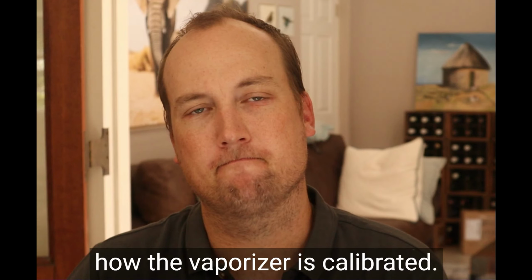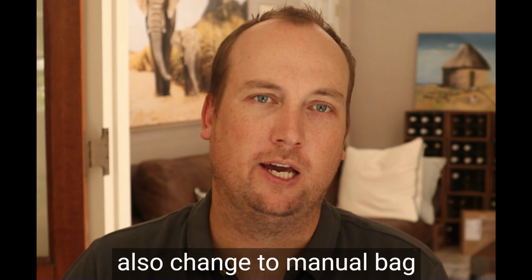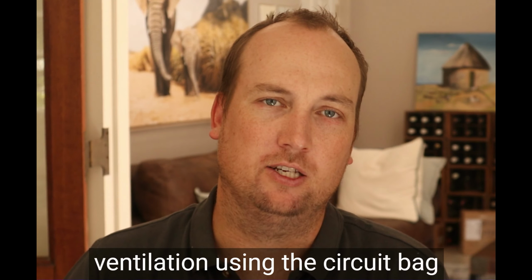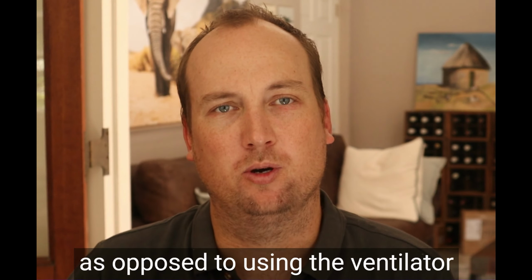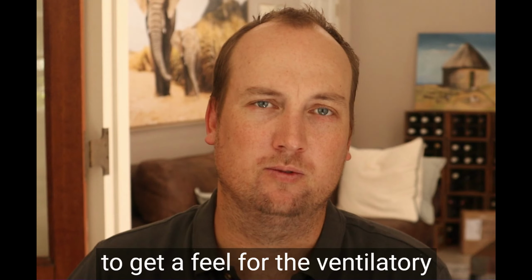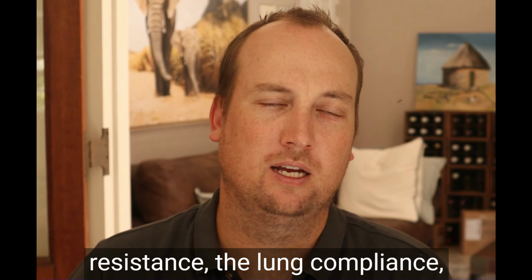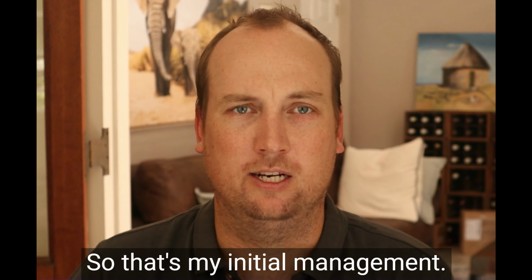I have to make that change because now I've increased the fresh gas flow, and this changes how the vaporizer is calibrated. In some circumstances, I may also change to manual bag ventilation using the circuit bag as opposed to the ventilator, to get a feel for the ventilatory resistance and the lung compliance, and to try to figure out from that where the leak is happening. So that's my initial management.